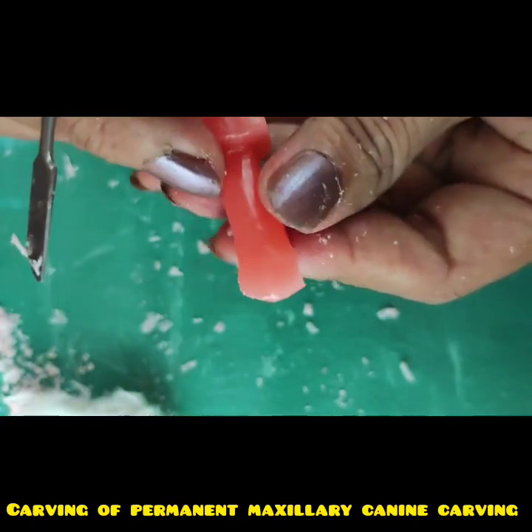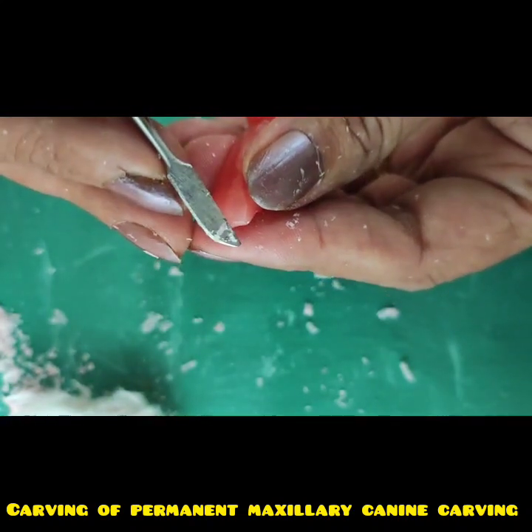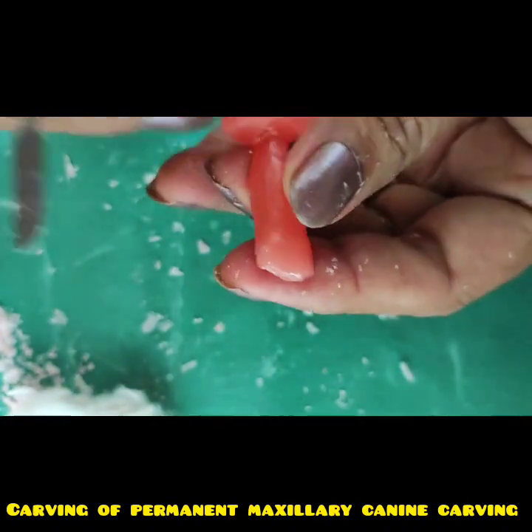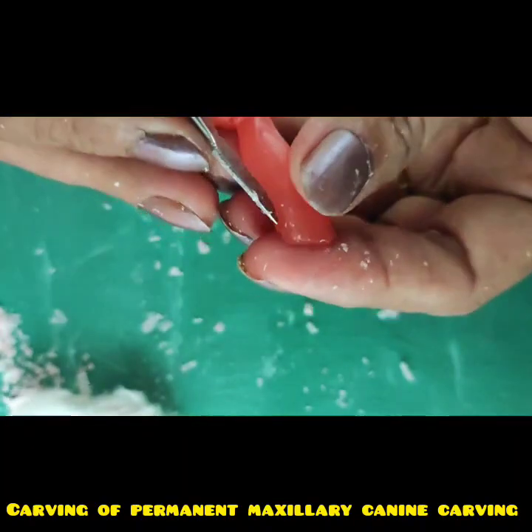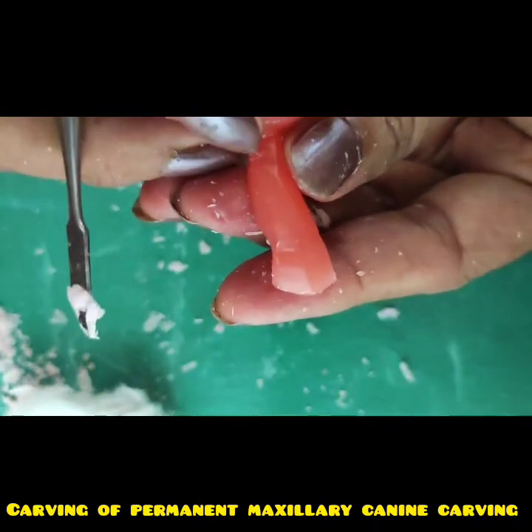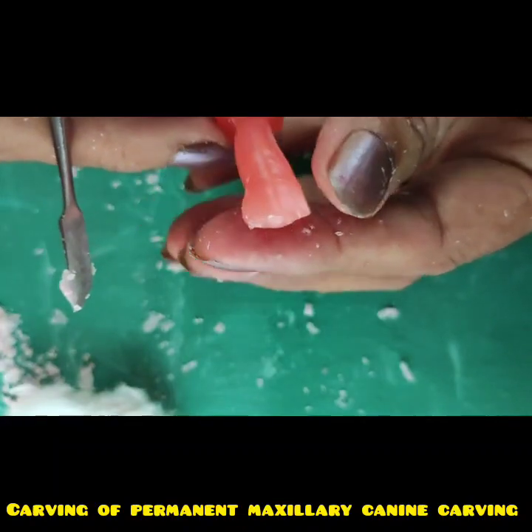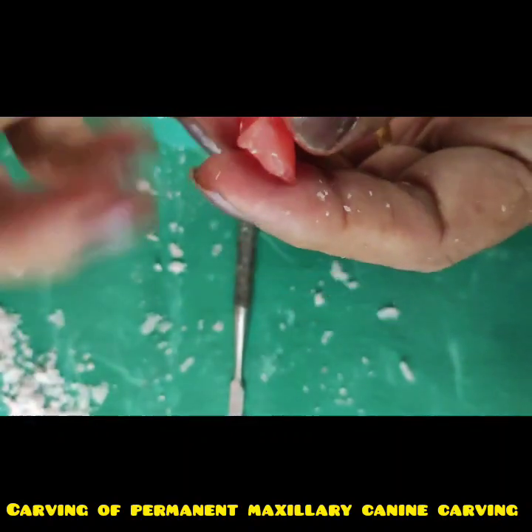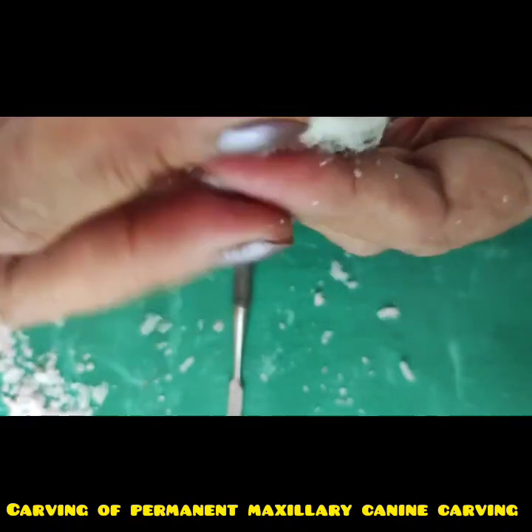And to give a natural look, the mesioincisal slope has a little concavity like this, and the cervical portion of the distal margin also has a little concavity. So like this. You can see the crown.